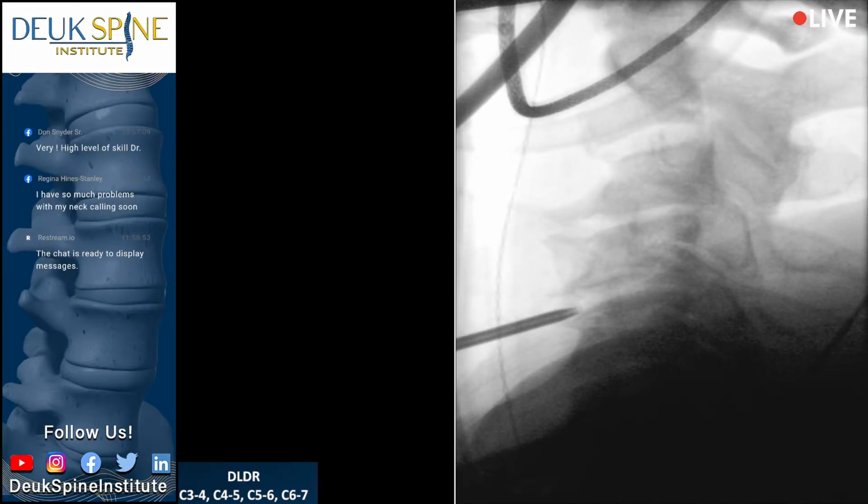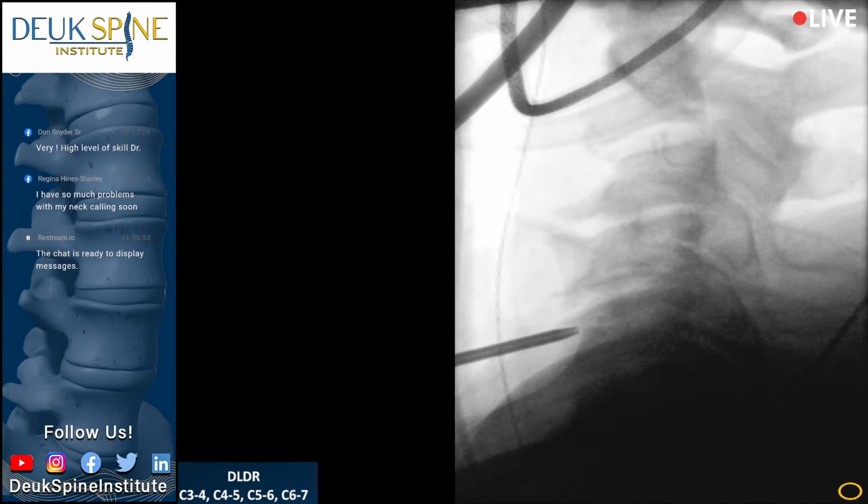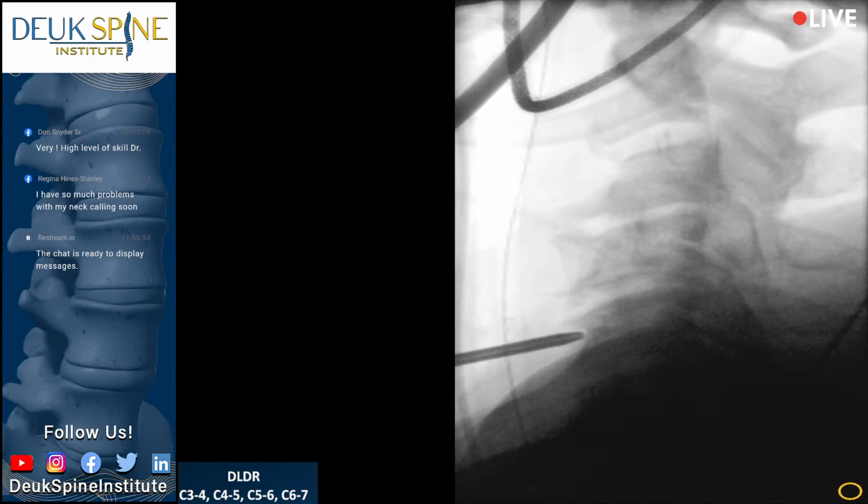I'm right on the edge. Shot. Could feel the bone spur. All right, shot. I'm outside. Good. I'm going to make my way down. Shot. I need an AP.